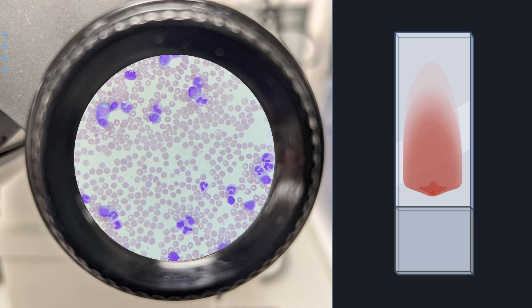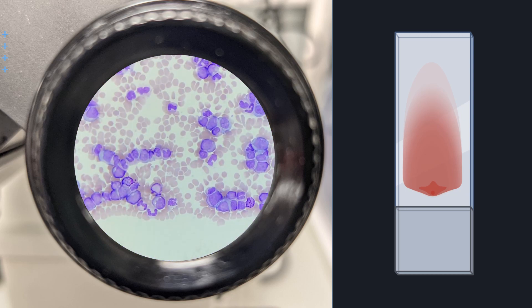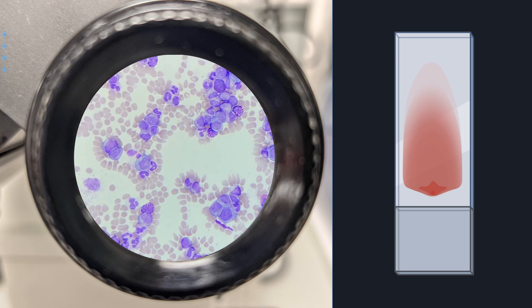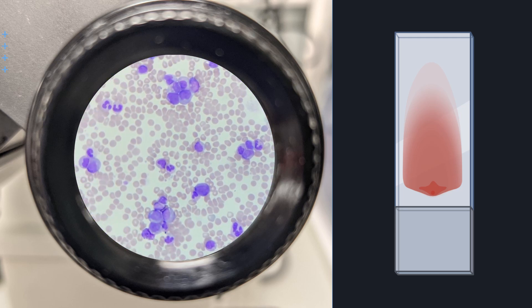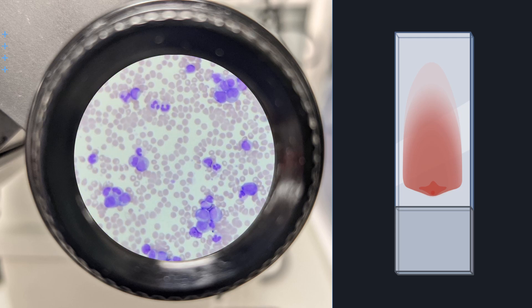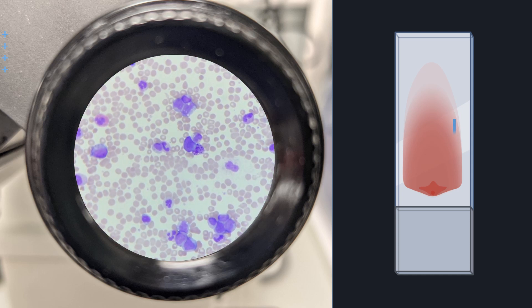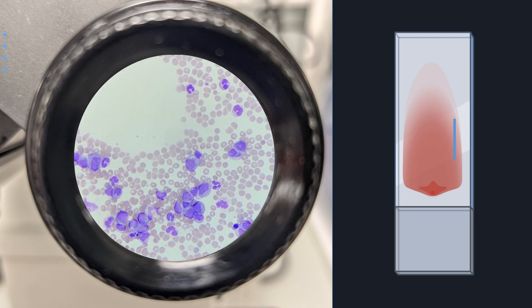Start by finding the edge of the smear and work your way in until you are in an area where the cells are close together without any large gaps in between and the morphology can easily be seen. Make sure the cells aren't overlapping either. Pick a field to start and when you're ready, count the different cells present. Once finished, take a point of reference at the edge of the field. I usually pick a cell and move the field until that is out of the picture. This will ensure you do not count the same cells repeatedly.